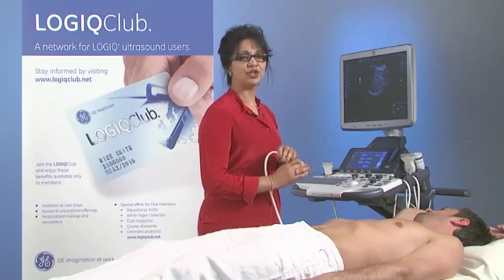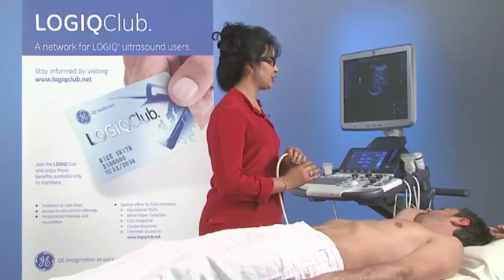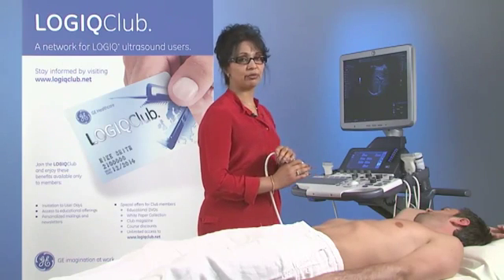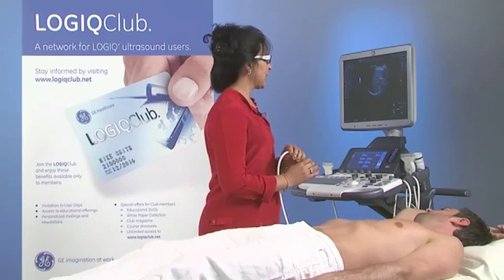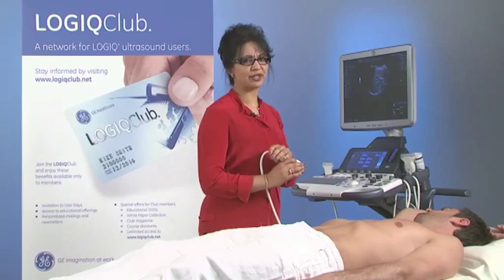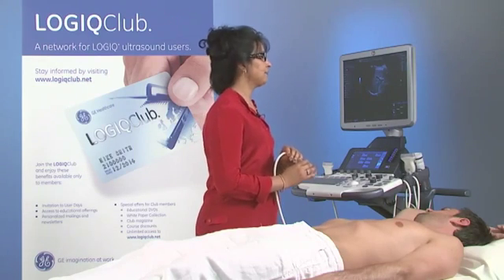If you have an image that is too soft and you're showing too many low-level echoes and you want to make it a little bit more contrasty, you can take down the dynamic range by reducing it a little. You can take down your frame average as well, and you can take up your edge enhancement. If you have an image that is too noisy, you may want to actually take your dynamic range down, take your gain down as well, and take up your frame average.